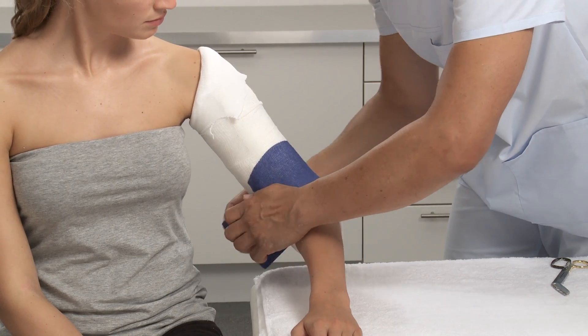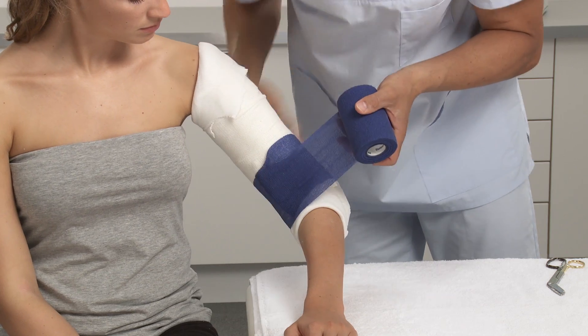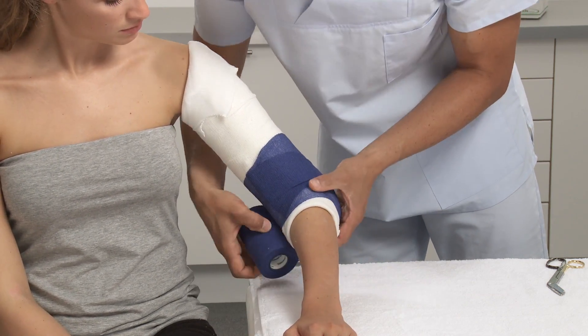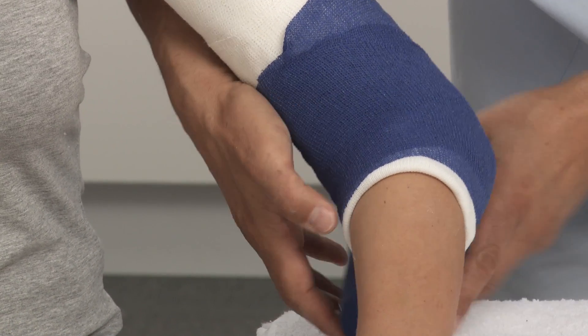Using an elastic or cohesive bandage, wrap at the elbow, first going distally, then proximally. Proceed up the arm, overlapping by 50% of the bandage, and fix.